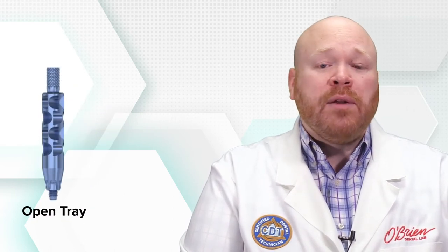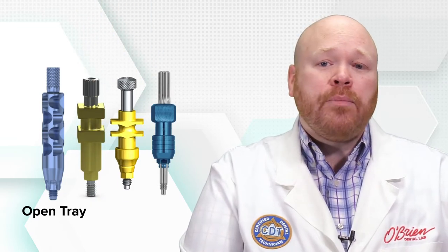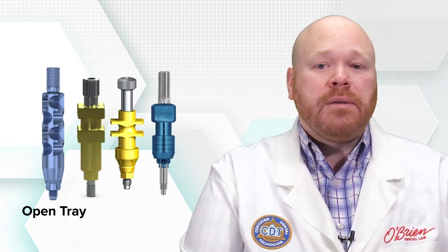The open tray copings, however, are very unique from what you would find with other systems. Most systems have rectangular retention elements that stick out of the impression coping to lock it into the impression. The EV copings instead have several divots evenly placed around the coping. These retention elements aren't as retentive as other designs, and therefore make it more likely for the impression coping to be rotated or dislodged from the impression.